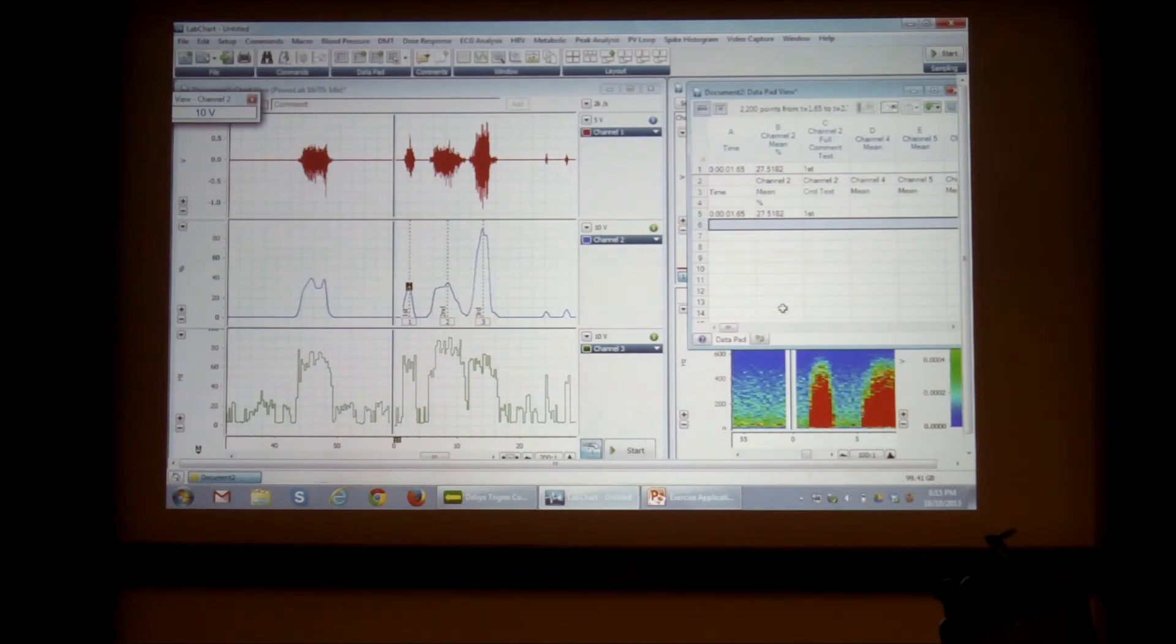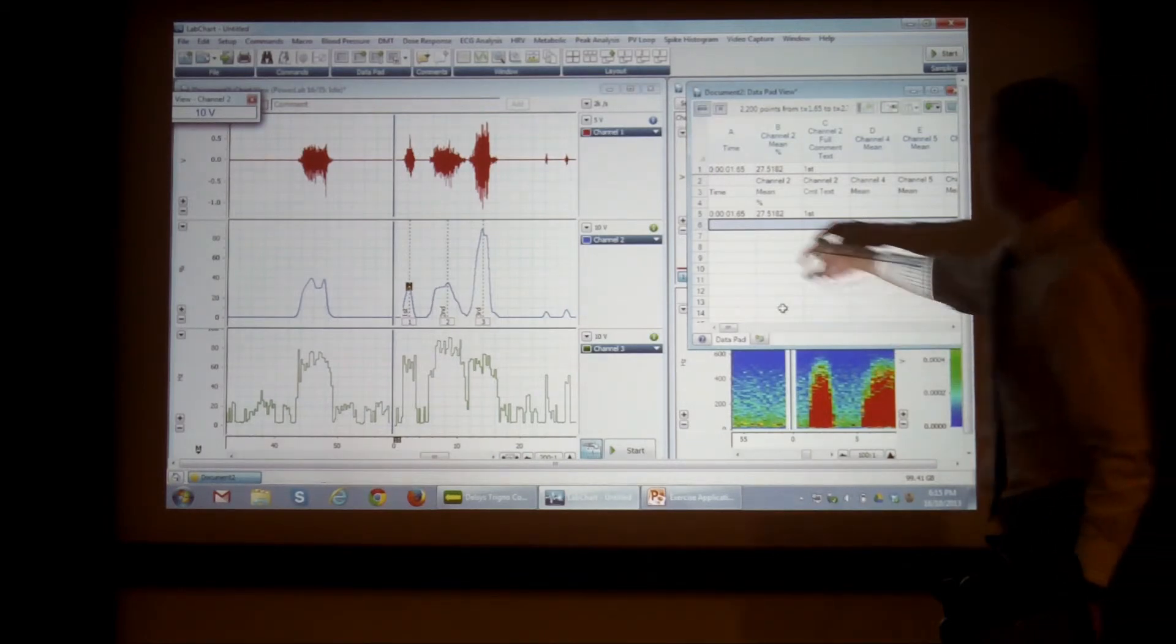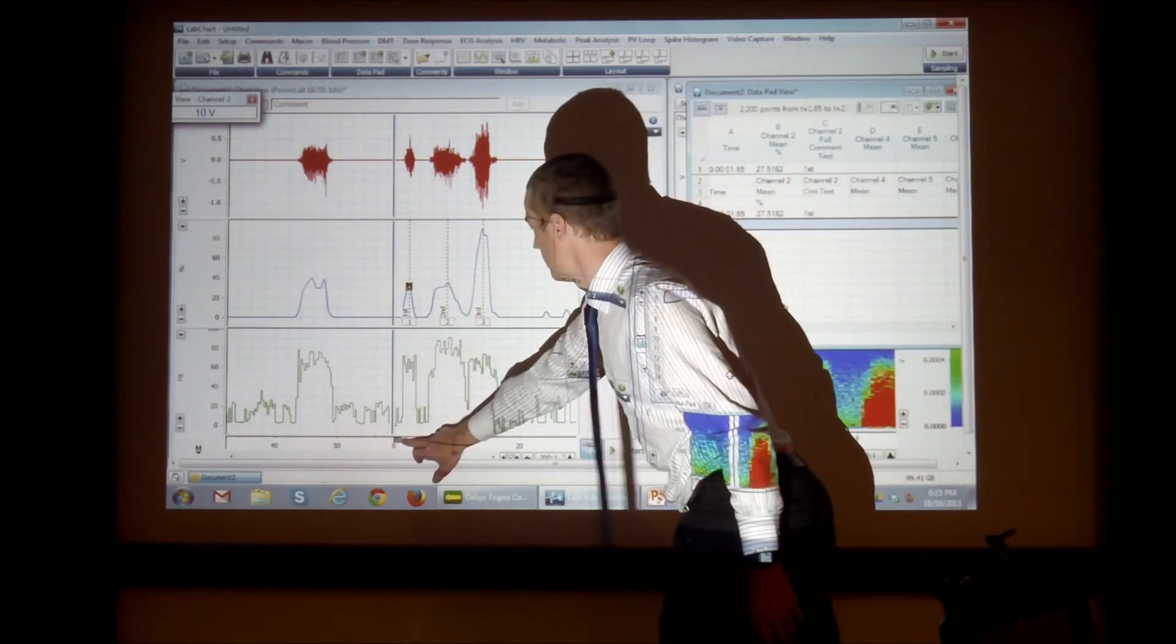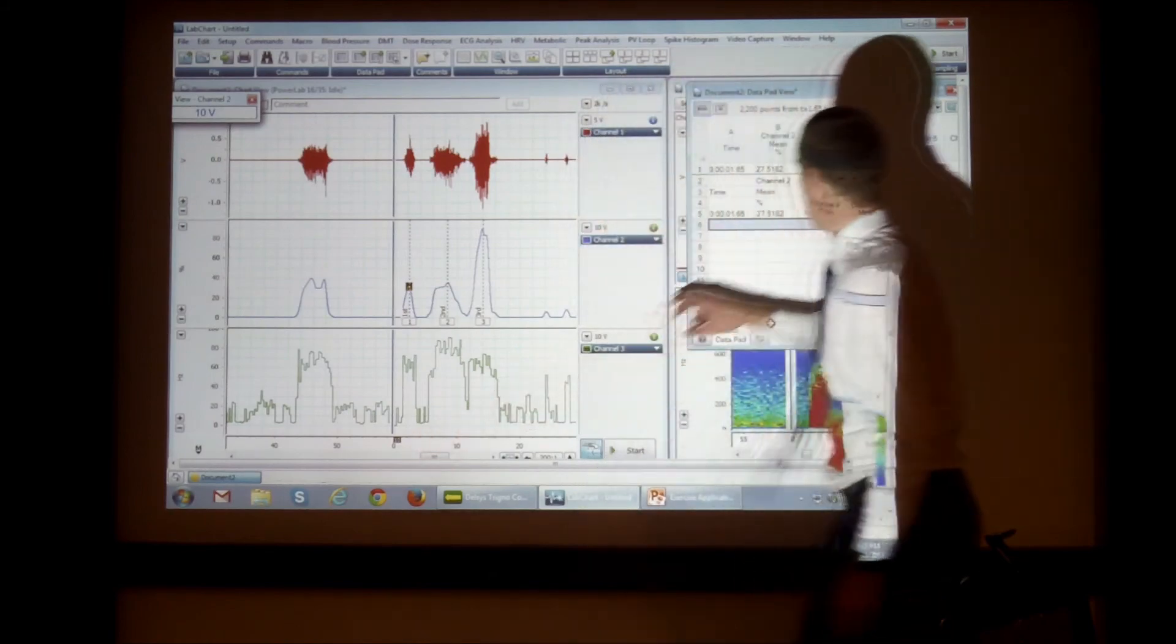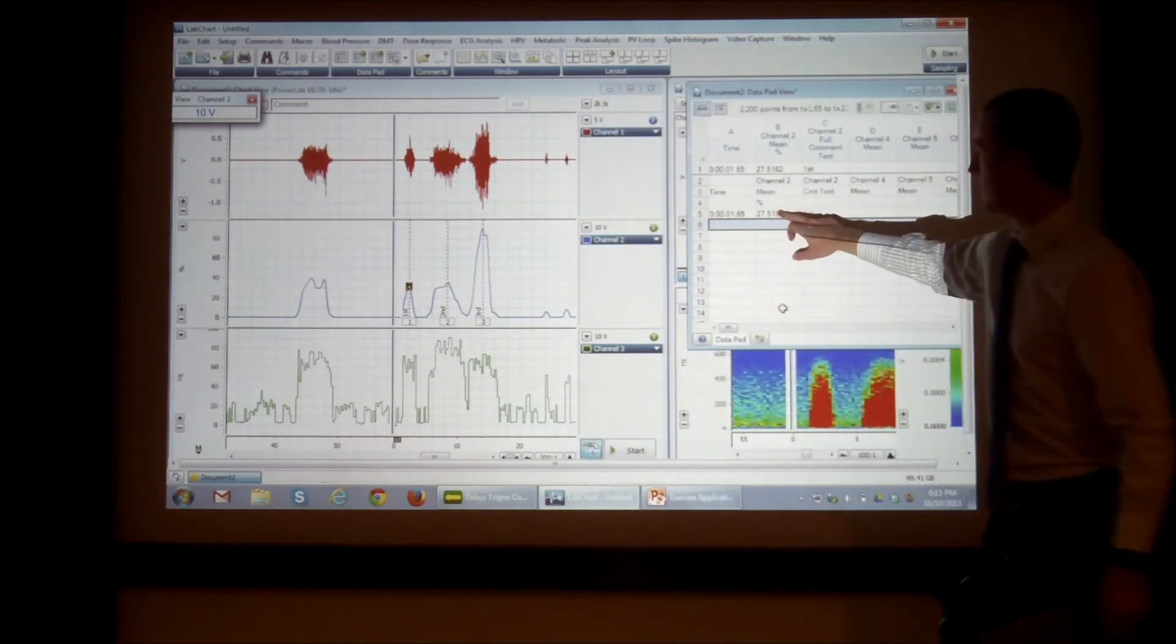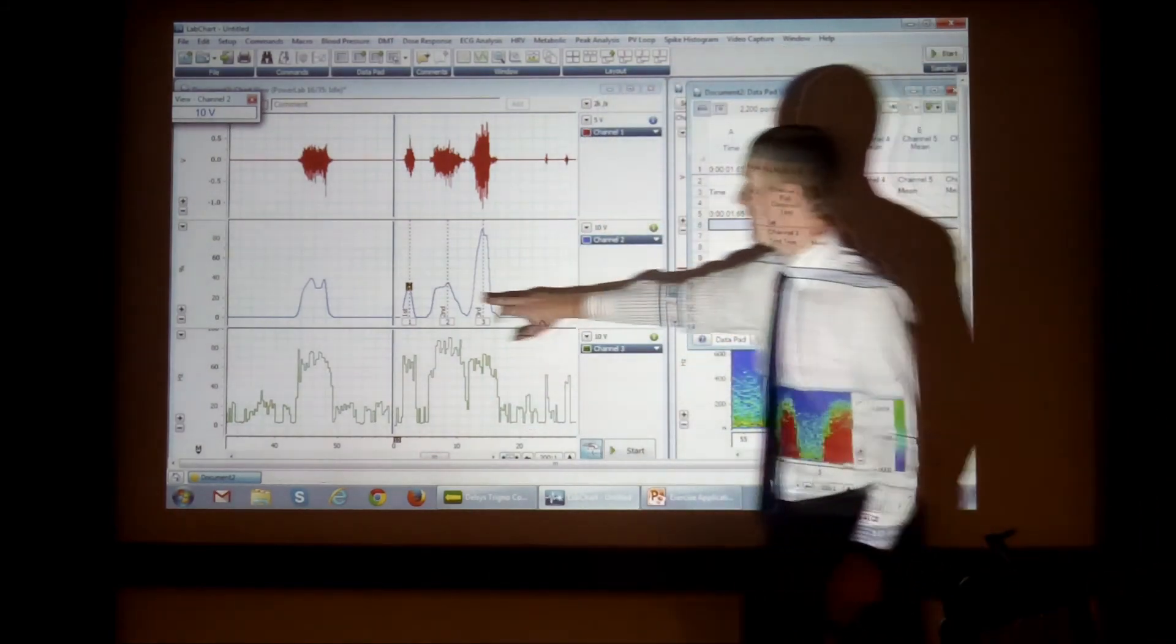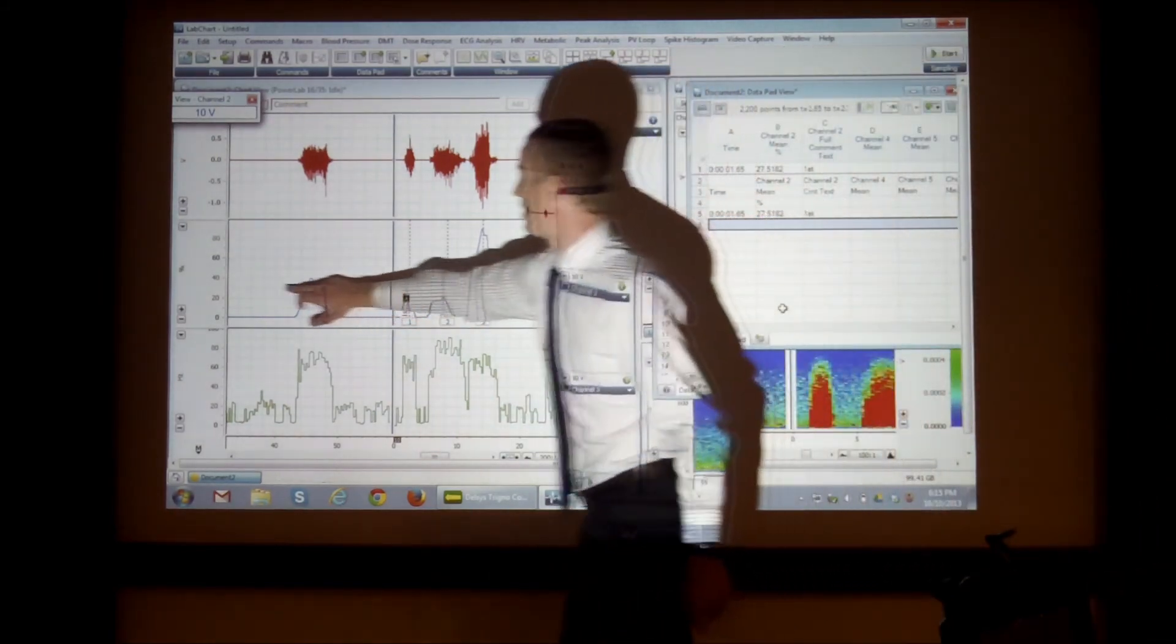So what it's done, it's added the time in my record down here. It's added the mean. So this is the mean percentage.